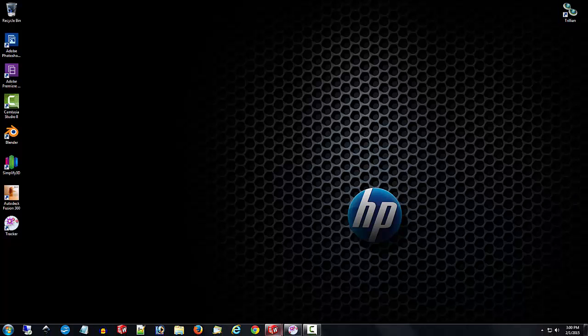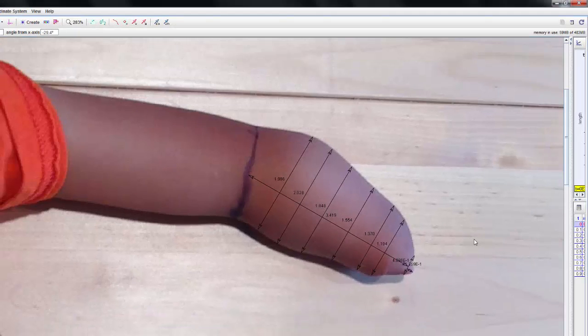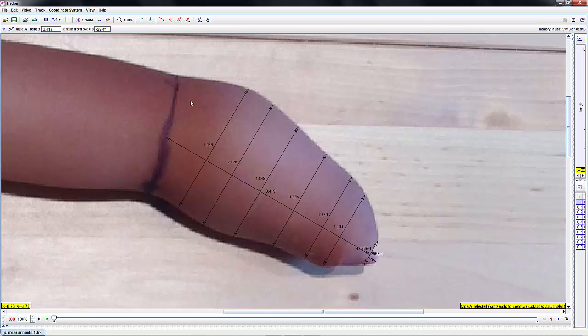Everybody who gets matched gets photographs of the recipient, and those photographs are taken with a ruler set next to the recipient's short arm. Most people are familiar with the tracker software — if not, search around the Google Plus page and you'll find links to get to that. Basically, you take a ruler and set a measurement scale, dragging it out in a one-inch increment. Then I'll come in and try to figure out a point in the mid area of the hinge point of the elbow, then drag out a dimension to the end of the forearm.